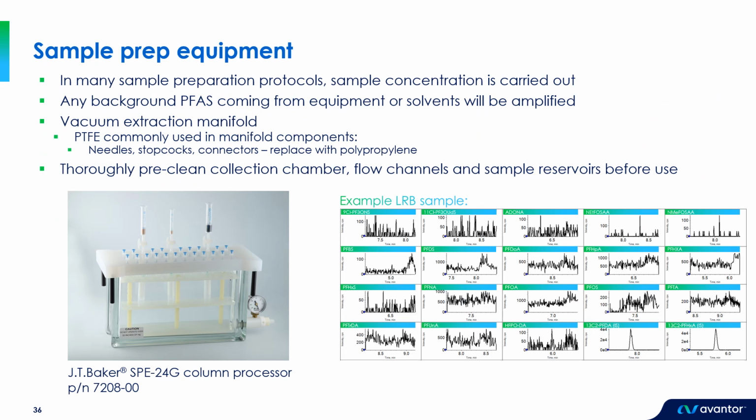So as we've discussed, many sample prep protocols utilize SPE, which is typically carried out using a manifold or column processor as shown in the picture. Because we're performing a sample pre-concentration, any background PFAS coming from the equipment or solvents will potentially be amplified using this approach.